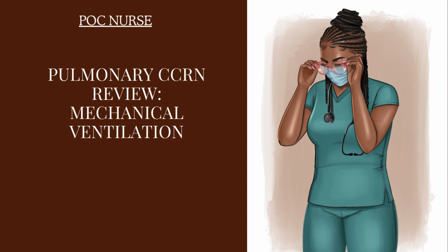Now we're going to talk about pressure support ventilation. In pressure support ventilation, the patient receives an increase in airway pressure when they're breathing in. This is to help boost the tidal volume that they are pulling on their own.